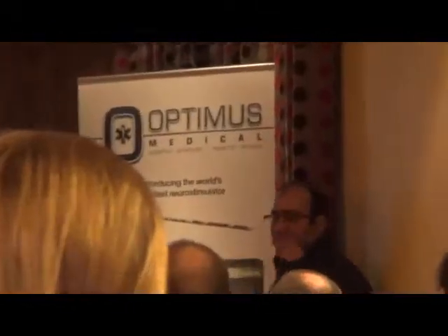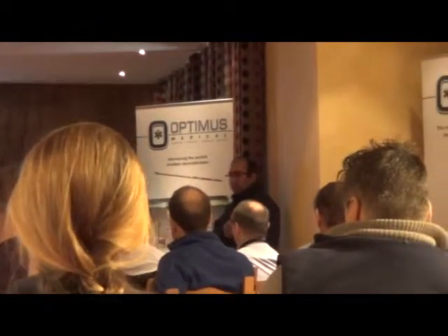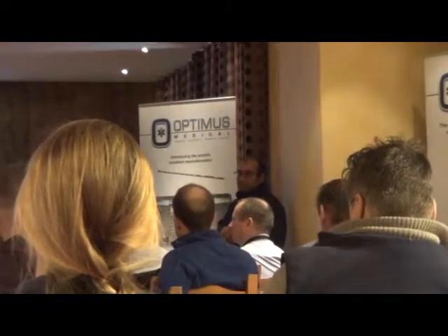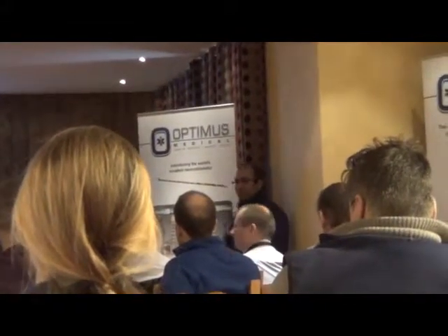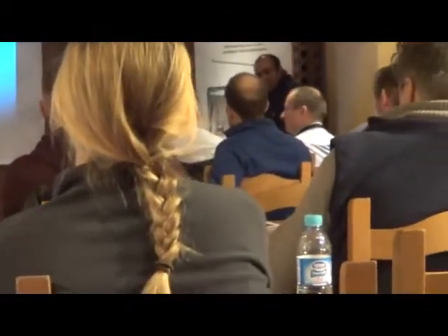Can I just ask Andres a question here? You mentioned transforaminal cervical epidurals and acute radicular pain. Most of them settle down within a month or two without any treatment other than medications. This is not my opinion, this is what is published. But then you never see this patient with a month of symptoms. True.